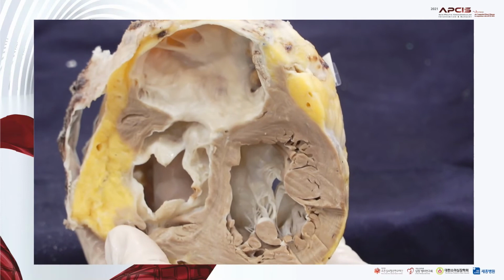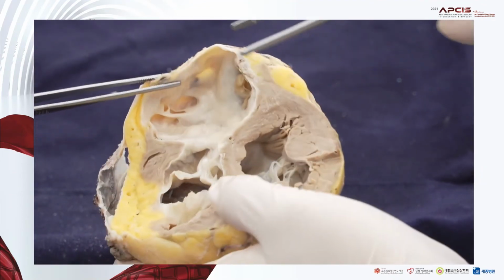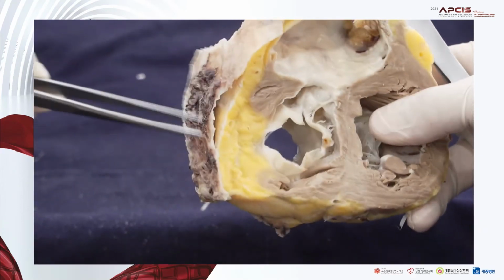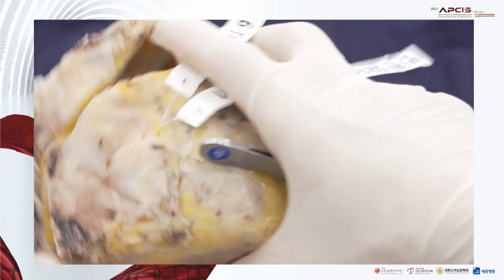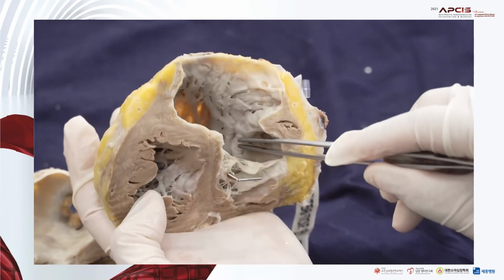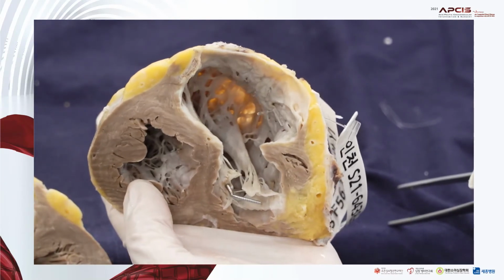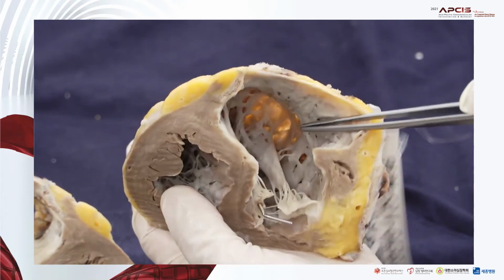Can you see any myocardium at the free wall of the RV? Next to this part has myocardium around here. No myocardium. No, the lower part, the inlet portion. This part is maybe above the atrioventricular junction. This is the immediate tricuspid annulus. I'm showing like this. So this is the right ventricular free wall, and there is muscular tissue in here. So the right ventricular inflow part is normal, and it looks like trabecular and outflow in there, between the tricuspid valve, and this is the ICD electrode.